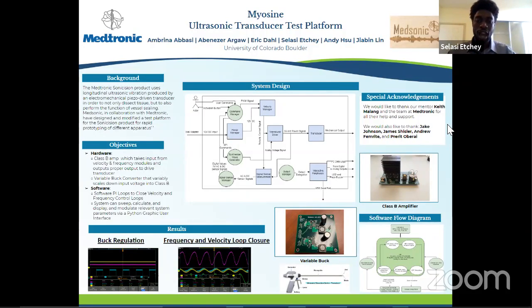And so what happens is we're using a frequency synthesizer, the chip on the motherboard, as the clock for not only running a lot of the system parameters, but the motherboard processor clock gets replaced with that frequency synthesizer clock. So when that moves around, the entire motherboard CPU frequency moves around. And so with that, our baud calculations are off, and we're not able to sustain an even baud rate between our host computer that runs the Python GUI and the processor side.